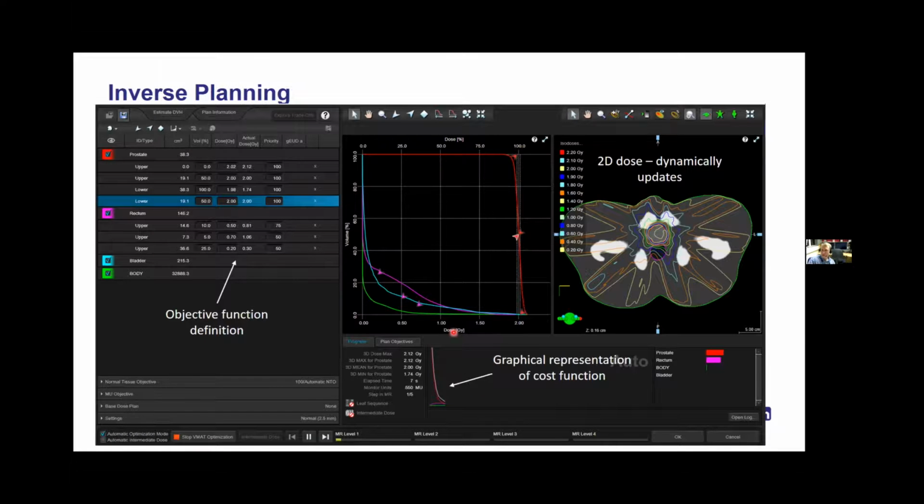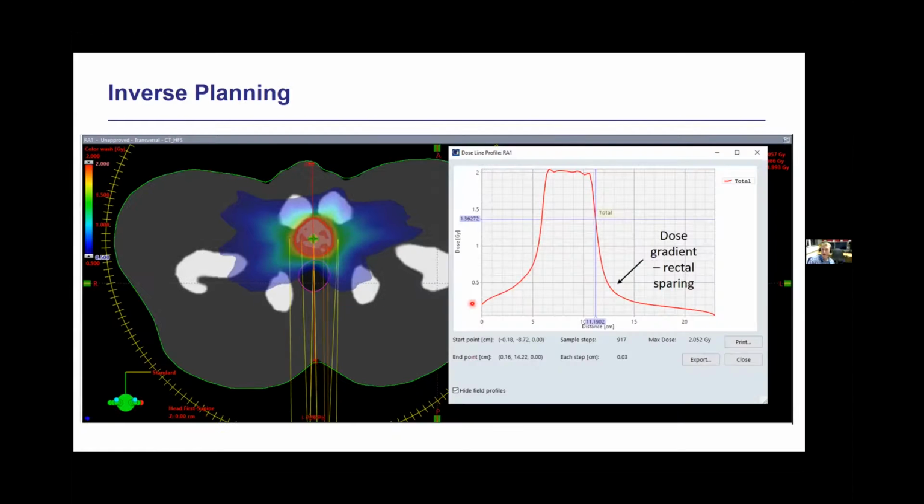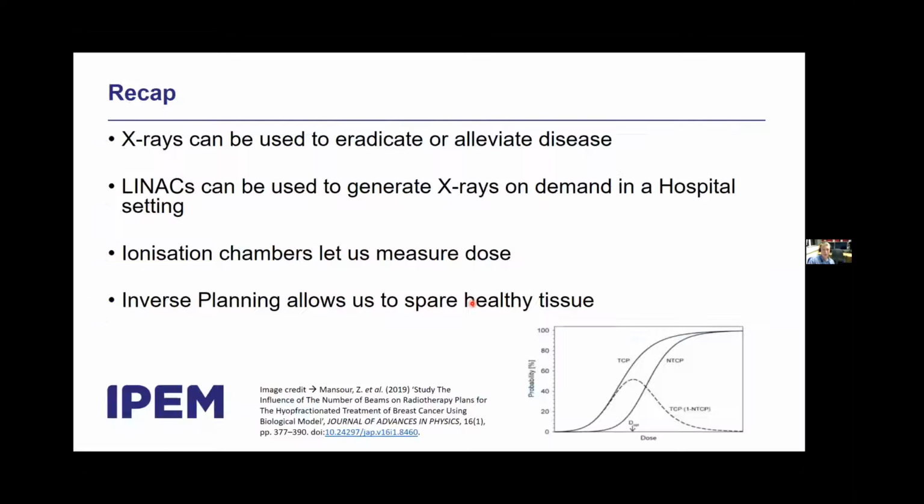And when the optimizer is finished running, we end up with a dose distribution that looks something like this. Now, notice how this is completely conformal in the high dose region to the prostate lesion. That's exactly what we want. The high dose is going exactly where we want it. And similarly, the optimizer has managed to derive a set of machine parameters that have scooped the 25% prescription isodose away from the rectum. This is maximizing our chances of uncomplicated control, all right, which is what we're here to do. So I hope that was clear.